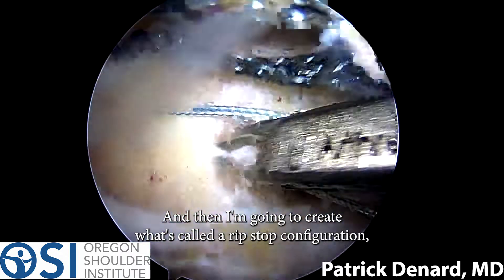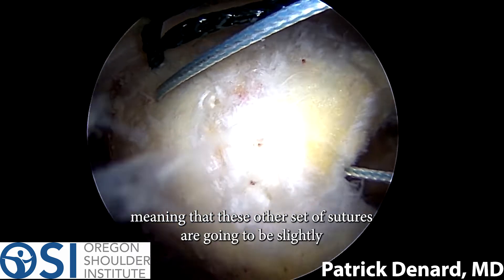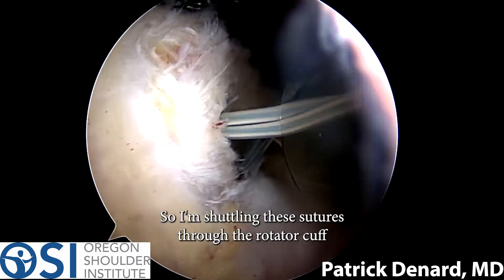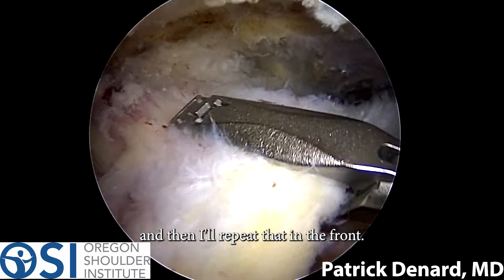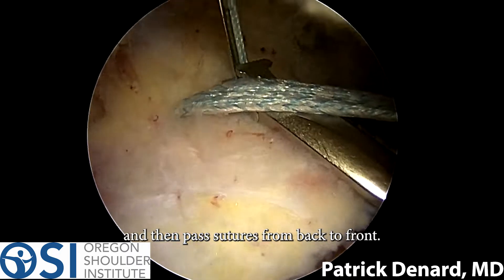I'm going to create what's called a ripstop configuration, meaning that these other set of sutures are going to be slightly to the side of the tapes to help prevent any pull-through. I'm shuttling these sutures through the rotator cuff, and then I'll repeat that in the front — placing anchors from front to back and then passing sutures from back to front.